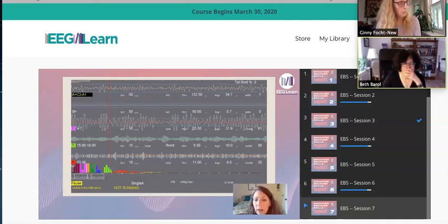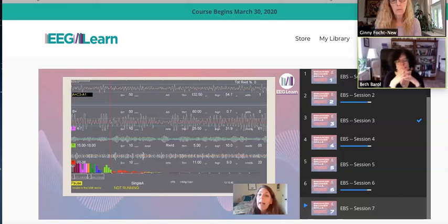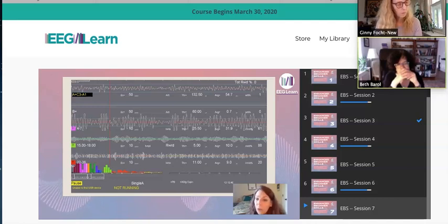I still have the other inhibit band to worry about. Again, this person has more than enough 22 to 36 Hertz activity. But chances are, as they bring their slow wave down, the other amplitudes will drop as well. Since right now the 22 to 36 is not necessarily the primary focus of my training, I'm going to set that threshold at a pretty easy level, and I'm going to give them more wiggle room than I would if this frequency was the focus of my training, right?